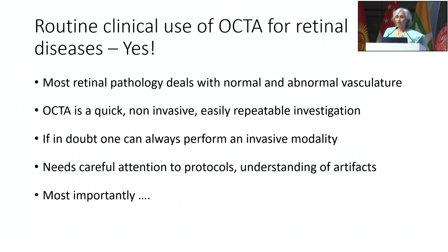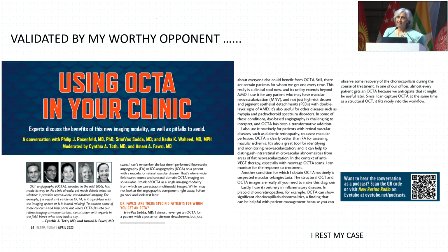Definitely there is a role for OCTA in clinical diseases. And what's more, it's validated by my worthy opponent, Dr. Sadda, who says he uses it for everything except a PVD. So I rest my case.